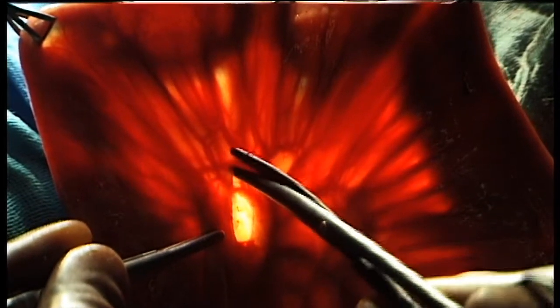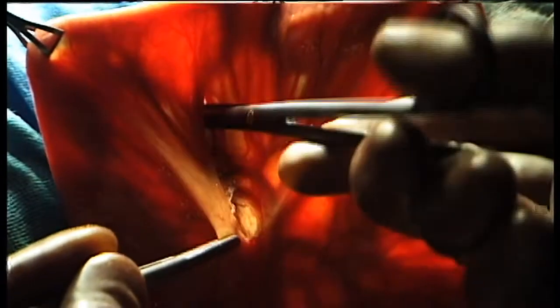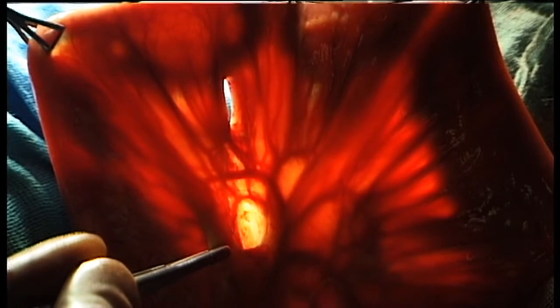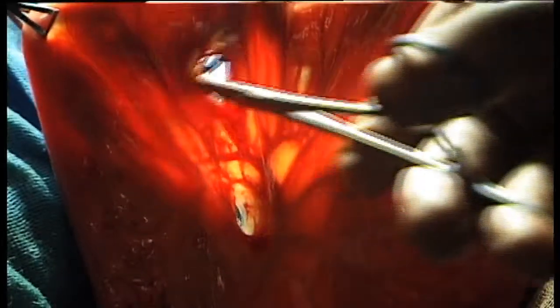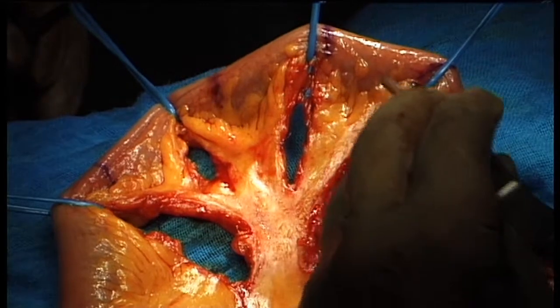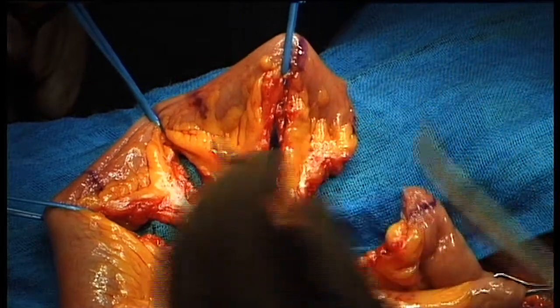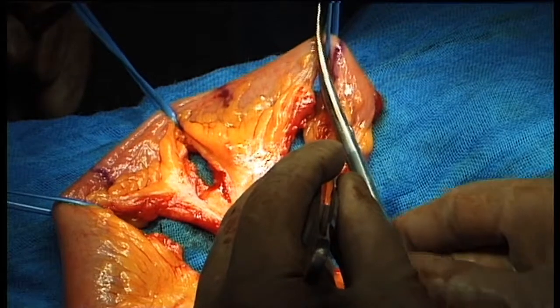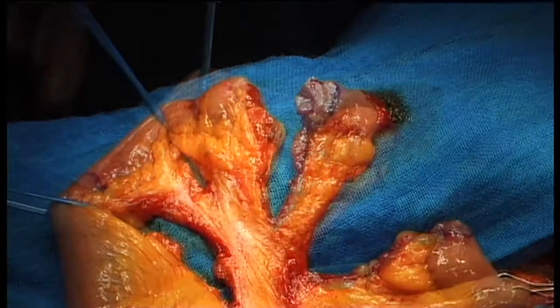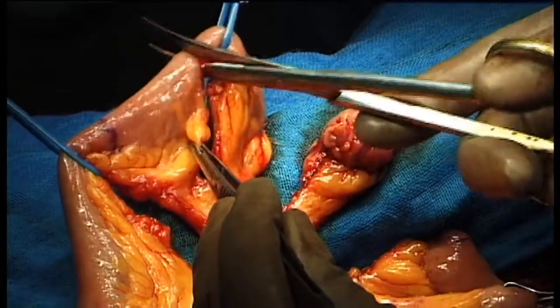Approximately a 7.5 cm segment of the distal ileum is isolated. Two windows are then created in the mesentery of this segment. In this fashion, the chosen segment is further subdivided into three equal parts. Soft bulldog clamps are used for temporary control of the blood supply of the three segments.